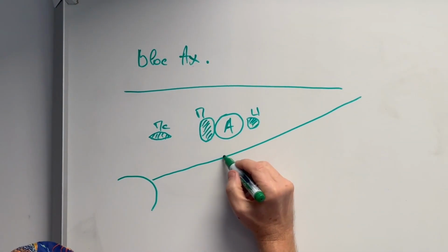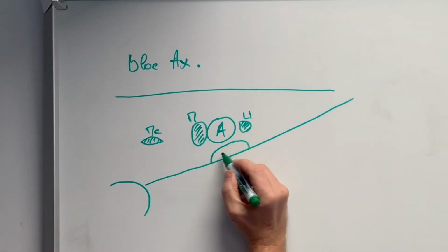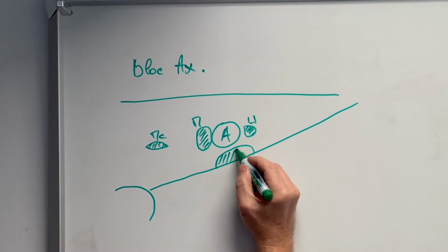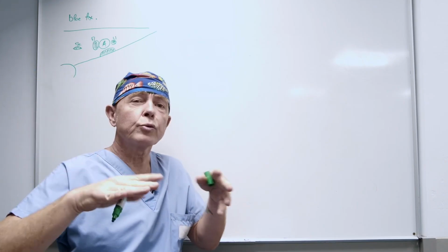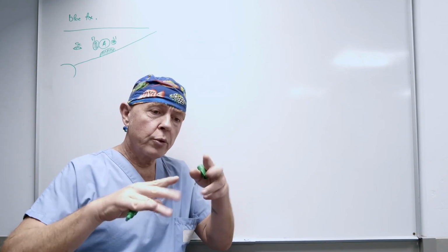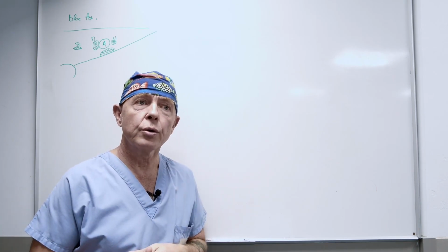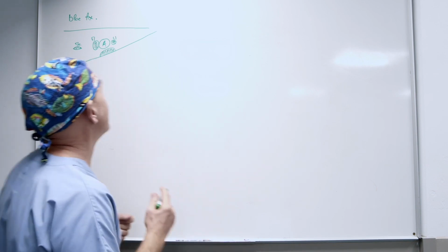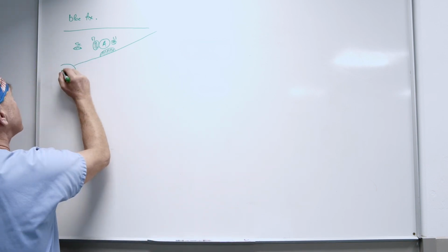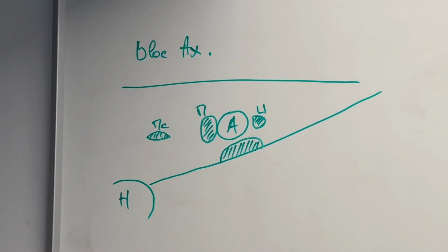Because at that particular level, the radial nerve, which might be somewhat challenging for beginners, is actually quite straightforward. It's somewhat similar to those divining rods used to detect things. They are oriented in different axes. So with merely one singular probe axis, it's difficult to have all four nerves in the identical plane. All right, so here we have it. These are the straightforward and fundamental components.